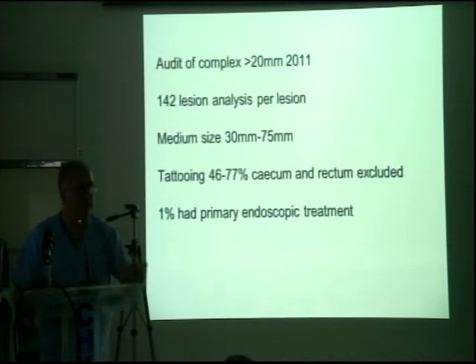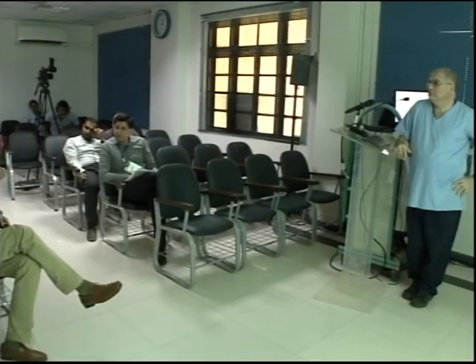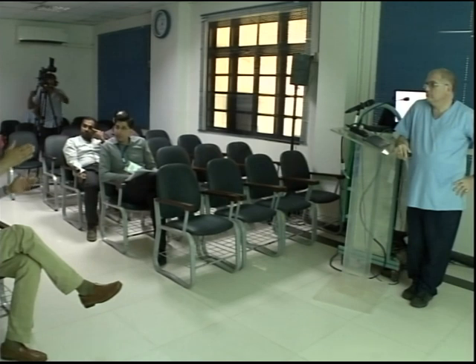Another important thing about tattooing is that, as Paul rightly described, it's a very pro-inflammatory agent. Technically, the reason it tattoos is because it's taken up by the macrophages and histiocytes and it stays there forever. The important thing is if it goes intraperitoneally, it causes a very intense peritonitis. So when you are injecting it, as we all do, we start off by injecting normal saline first.